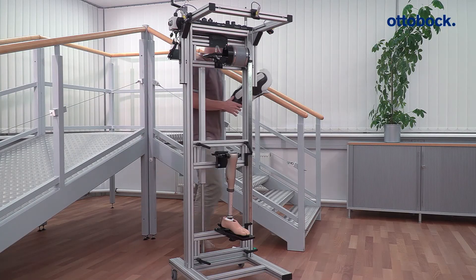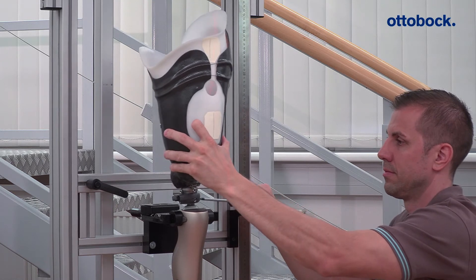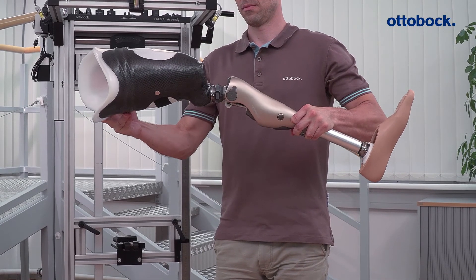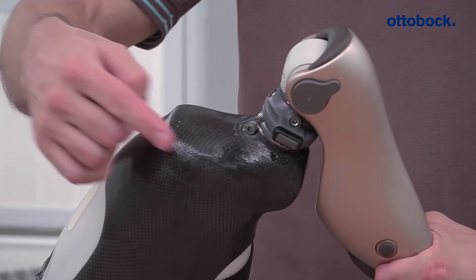Then connect the socket to the knee joint. Pay particular attention to the socket flexion position specified in the alignment recommendation and adjust the components accordingly. Check the distance between the socket and the hydraulics in the maximum flexion position of the knee joint.